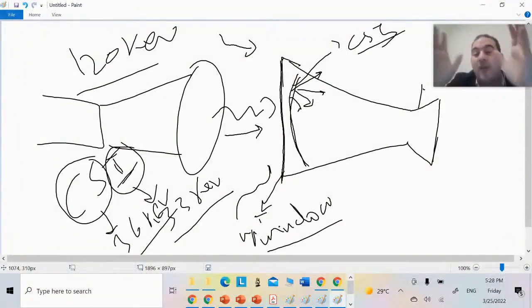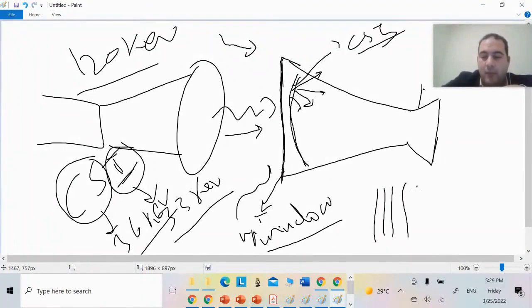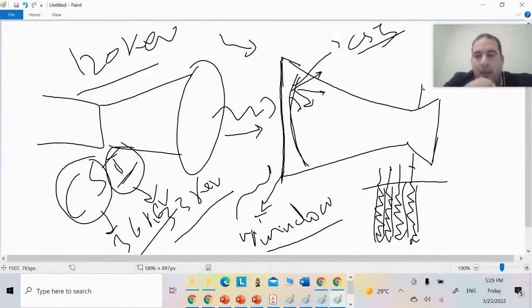It was mentioned that cesium iodide has the property of being like a needle, in the form of needle tubes like this. When a light photon is generated, these needles help it travel along this path without experiencing diffusion. So, we have converted one X-ray that hit the cesium iodide into 1,000 light photons. That's great.